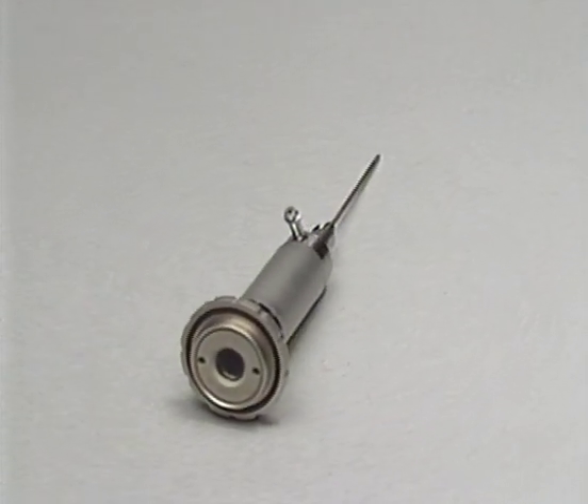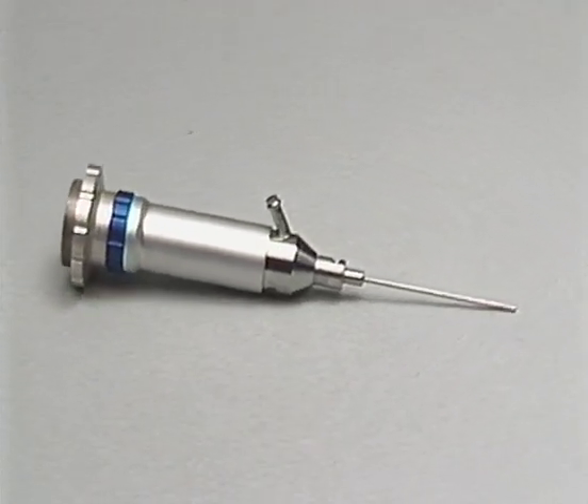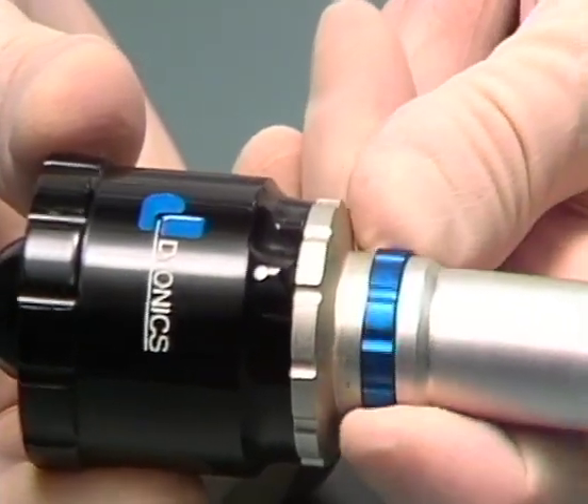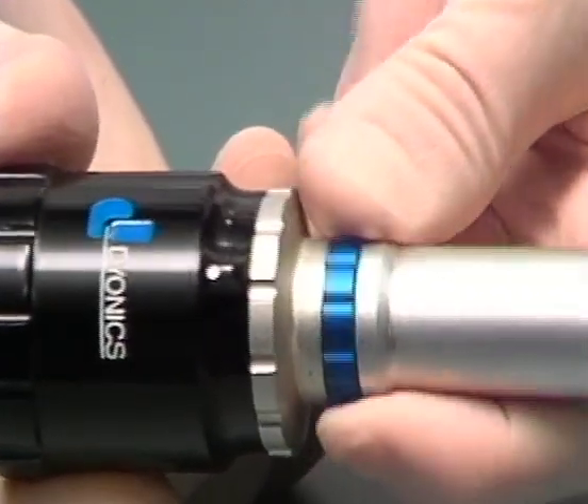Each arthroscope is composed of three systems: an optical system, a viewing assembly that transfers images to a monitor for display, and a light source to illuminate the joint space. The optical system includes a focusing ring to obtain the sharpest image possible for a particular examination field.